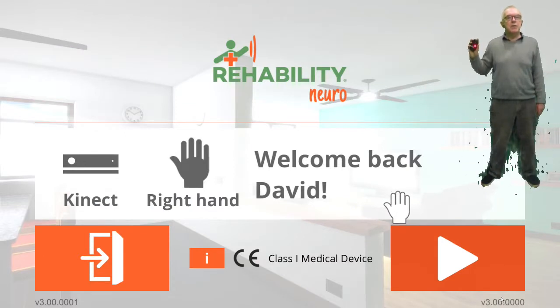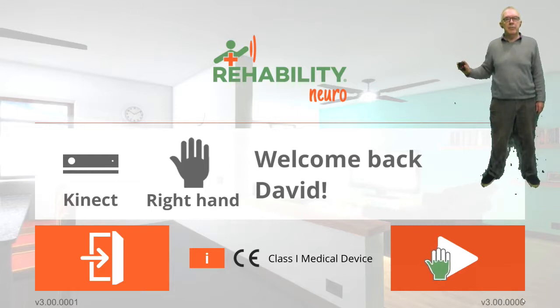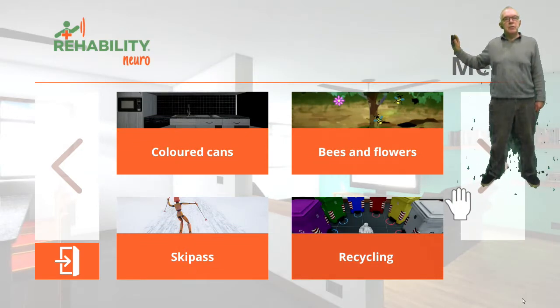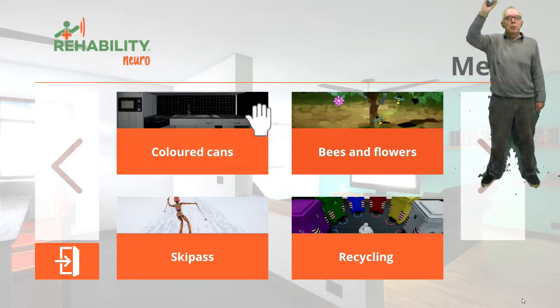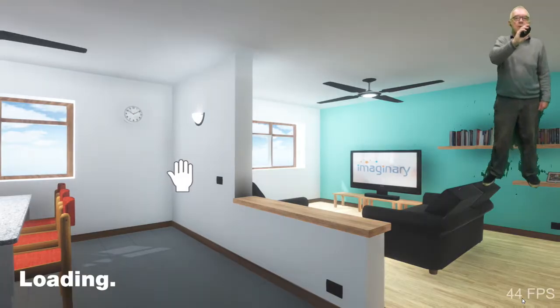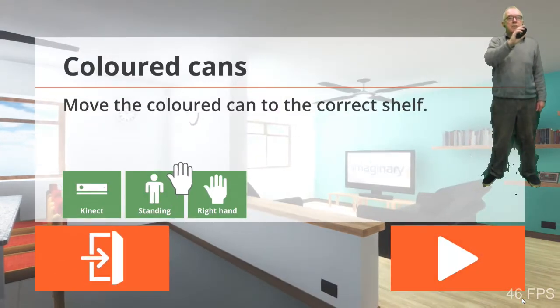It tells me that I'm using my right hand, and I'm using the Kinect, which is a device which typically the clinicians would use at a rehabilitation clinic. So I'm ready now to start to play the game, and because I chose to play these games in any kind of free-form sequence, I can move my hand and select the game that I want to play. Well, I'm going to begin with the coloured cans game.